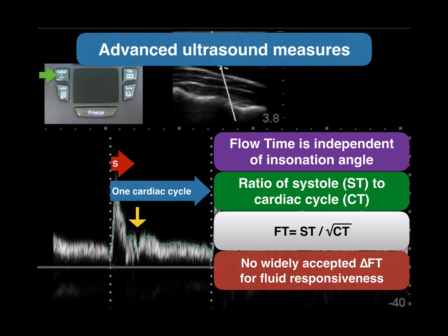There is no widely accepted cutoff for flow time because it is so relatively new. However, if the flow time is 0.3 at baseline and then increases to 0.5 after a passive leg raise or fluid challenge, you can assume that the patient will be fluid responsive.